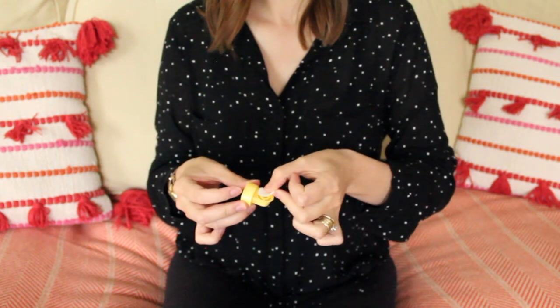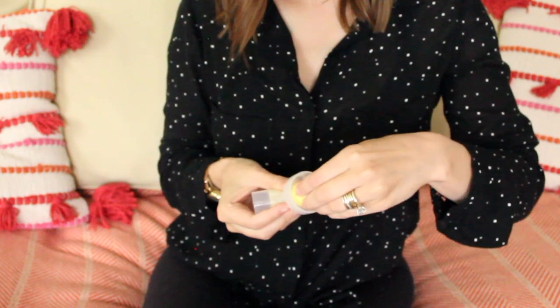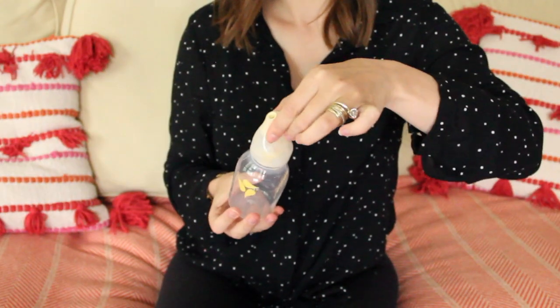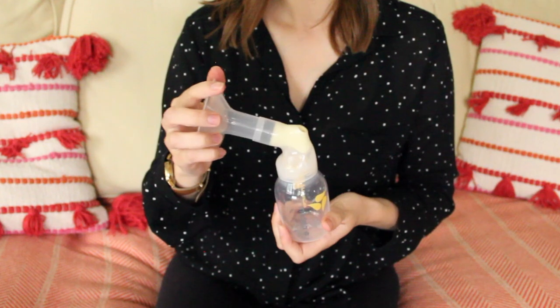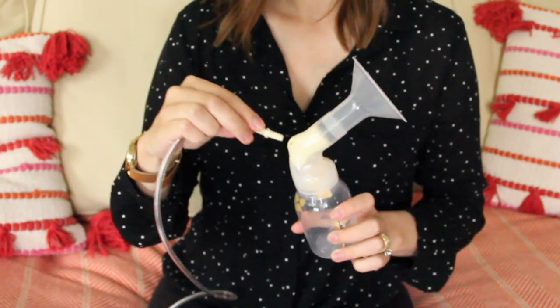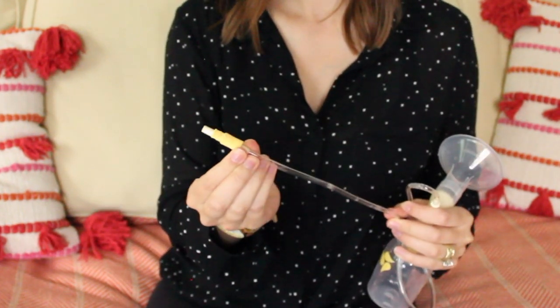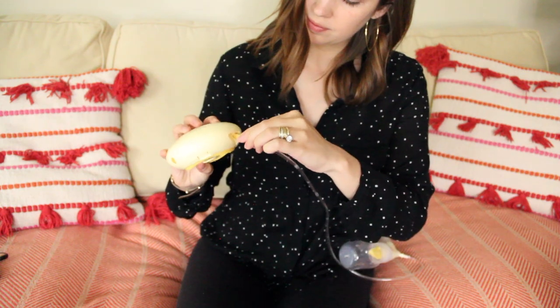Assembly might seem overwhelming at first because of all the little parts, but I promise after a few practice tries it'll become second nature. To get it all assembled: the white membrane snaps onto the valve, the valve fits onto the inner ring of the connector, the bottle itself screws onto the connector, the brush shield fits on the opening on the connector, and the hard yellow adapter end of the tubing inserts into the top of the connector. The other end of the tubing, the one that has the triangle shape on it, fits into the pump's motor, and now that it's all together, you are ready to pump.